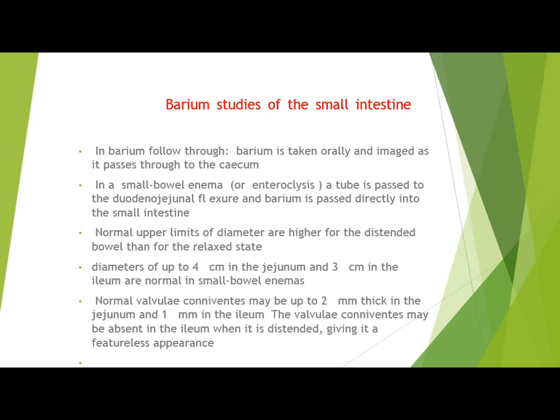The barium study of the small intestine: we can do the barium follow through, when barium is taken orally and imaged as it passes through to the cecum. Or we do a small bowel enema, or enteroclysis. A tube is passed into the duodenojejunal flexure, and barium is passed directly into the small intestine.